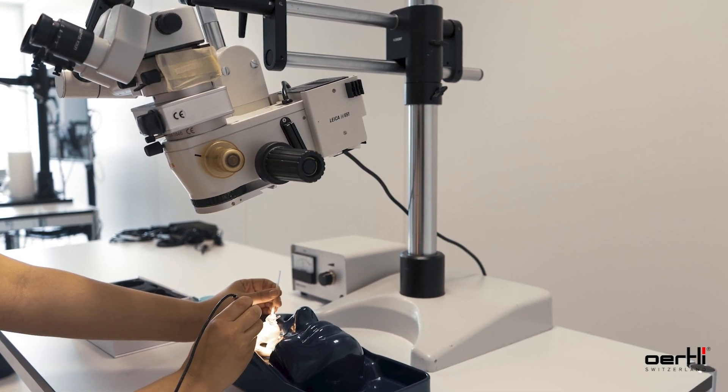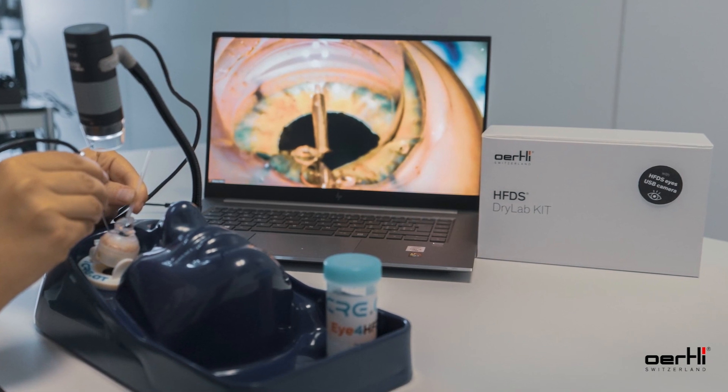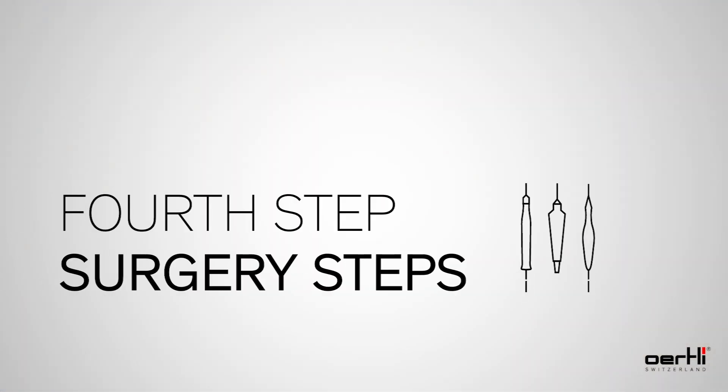You can also demonstrate HFDS with this dry lab kit in a general wet lab environment. Step 4: Surgery Steps.